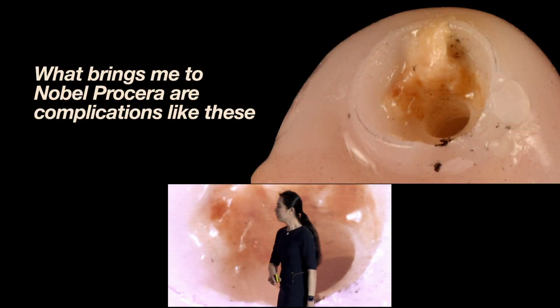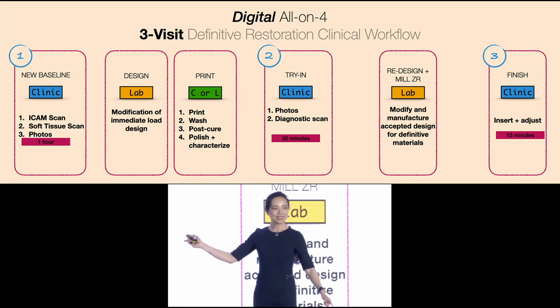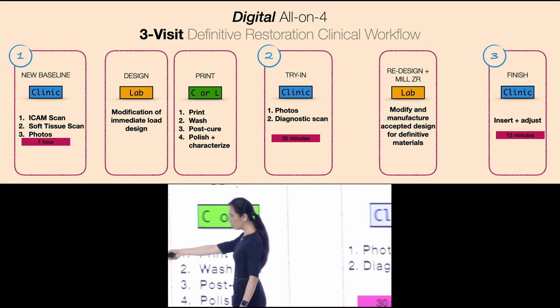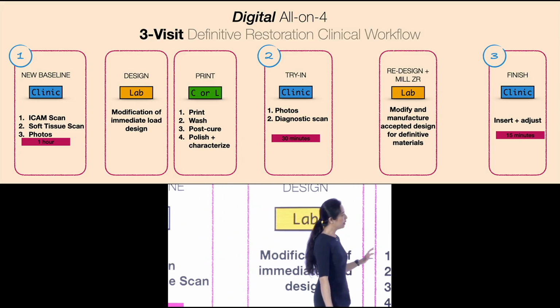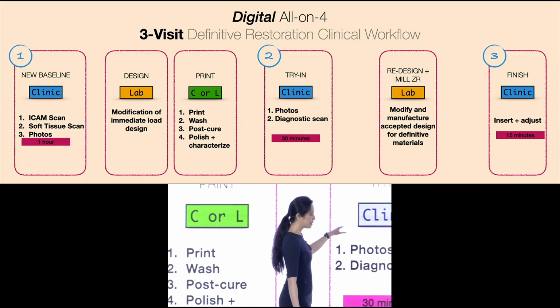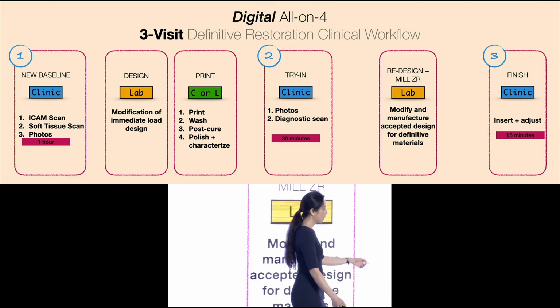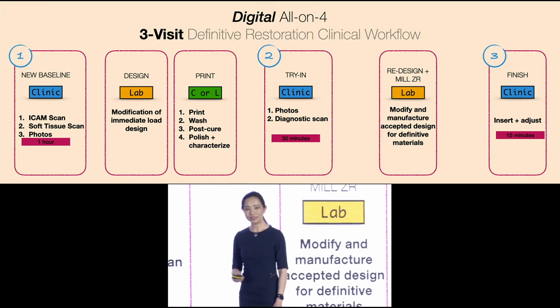Oh, sorry. So if you look at the actual clinic flow, it doesn't take much from start to finish. Still, the longest time you're going to take is at the beginning, where you're talking to the patient about what changes they want to make. And from there, all this is passive. The next time you see them, the restoration will drop right in, because there shouldn't be any real adjustments. And assuming that they're happy, the final zirconia only takes 15 minutes, because everything's dialed in again.